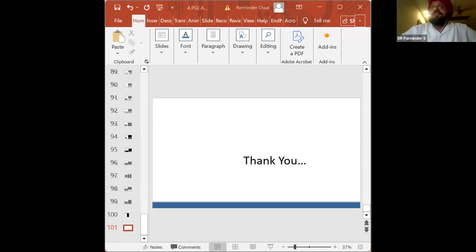True, we've become lazy. I just put it on 312 and use the automatic tools everywhere. I think the advantage of doing the manual things, for the beginners, is that we can understand the problems, nuances, artifacts, and issues, because even if you do it automated, you have to supervise it.